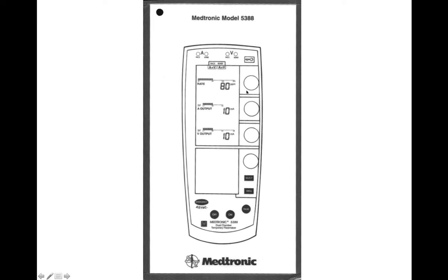Just familiarizing yourself with the main interface here — this is the lock button right here. This is the lock interface, which will keep you from making mistakes or somebody inadvertently changing settings. This is your pacing and sensing indicators for your atrial and ventricular outputs, so you can see what's actually happening on the pacemaker itself without having to look at the rhythm.